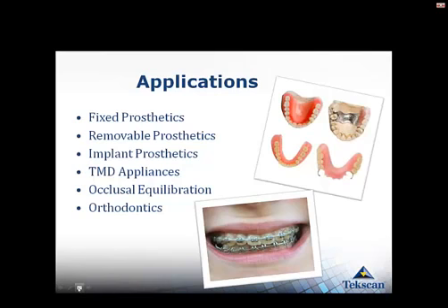Some of the applications, sometimes people ask me and they think it's only used for one particular type of material. Really, it can be used on dentures, orthodontics, as I mentioned previously, TMD appliances. It's not just occlusal equilibrations. It's really a variety of different things within your practice.